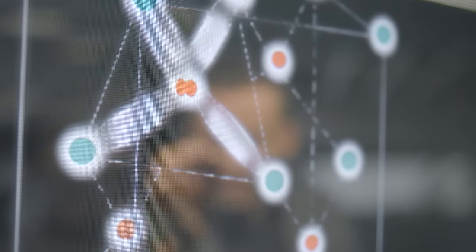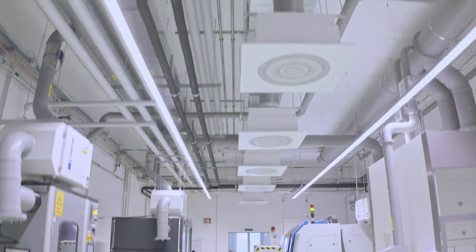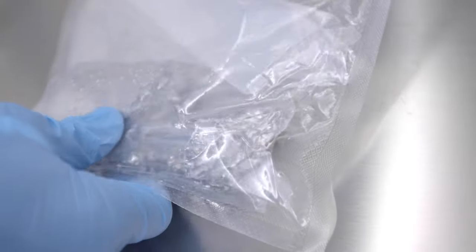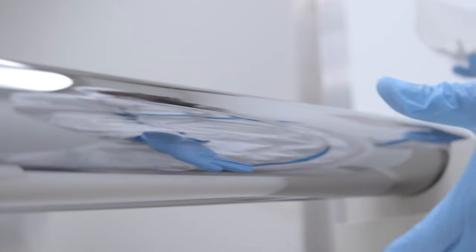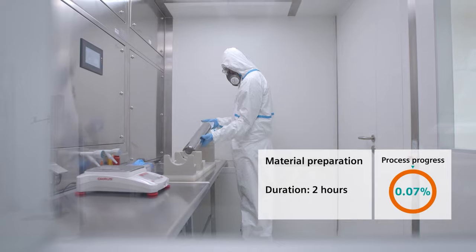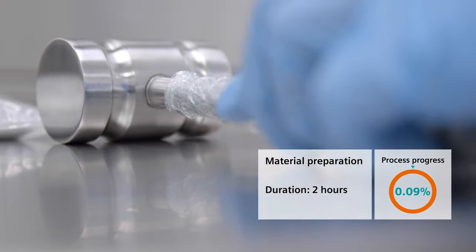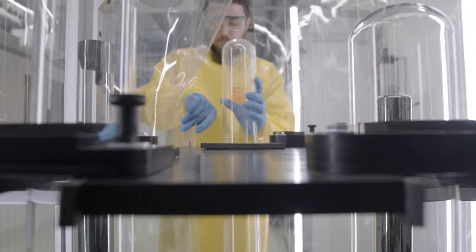The big challenge is the absolute purity, the crystal perfection, and thus the electrical properties of the crystal. This means that all the rooms here in the new building have to be at clean room level. However, many of the substances here are toxic, so we had to partially reverse the principle of the clean room and suck the air out instead of blowing it in. This necessary purity goes so far that even the material of the hammer used to crush the raw materials must be specially selected, and that not even the smallest particle of contamination enters the process.